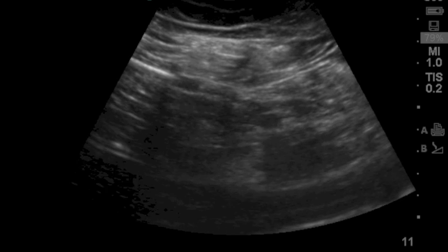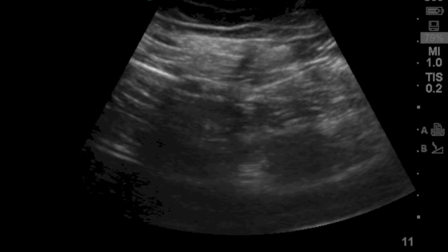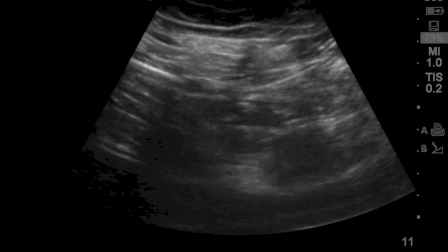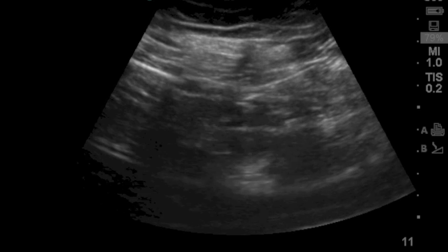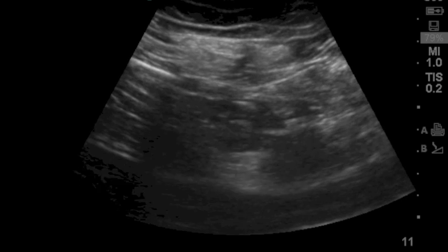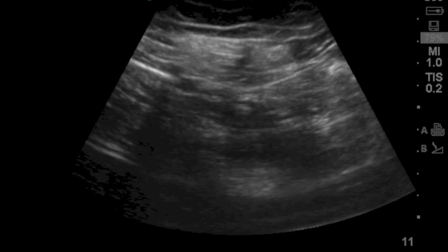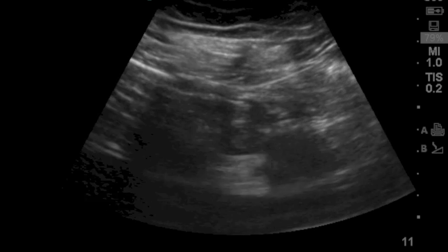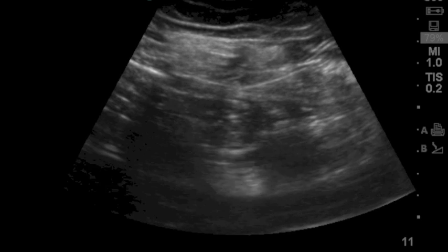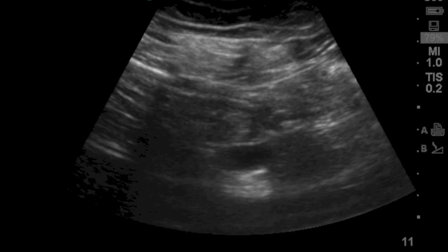The things to ensure you avoid: you don't want to be hitting femur, you don't want to be traversing femoral vessels, and as such an out-of-plane approach is advisable for this block. We use 30 cc's of local anesthetic — usually ropivacaine 0.5%, however quarter percent marcaine for one-shot blocks is frequently used. You can now see the local anesthetic infiltrating just above and around the nerve in circumferential spread. Keep in mind that the sciatic nerve is very large, and onset to achieve a strong block can definitely take a good 20 to 30 minutes.